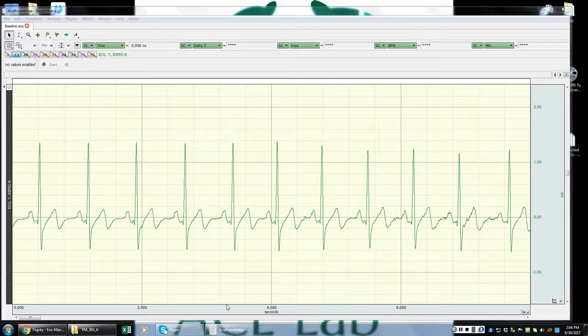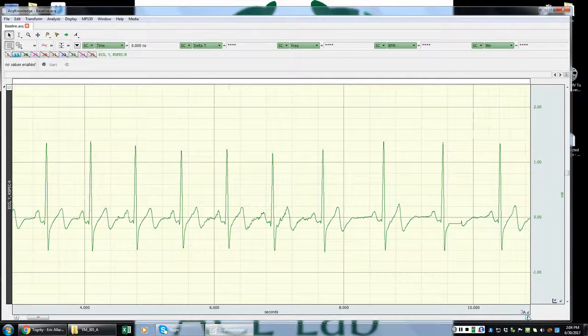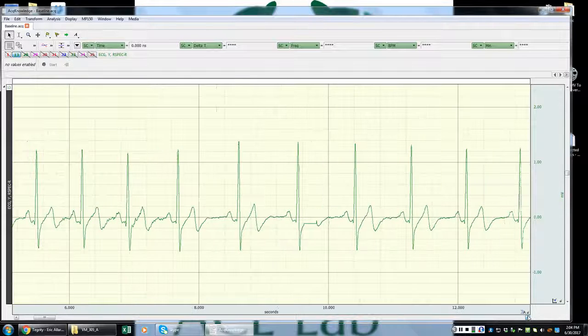Now, what you'll see to start with, this is the beginning of a baseline condition for a particular participant. All right, you'll notice at the start here, I've deselected all the channels with the exception of the ECG channel. And at first glance, these first few R peaks look pretty clean. They look pretty solid. This would be the type of signal that we would actually want.